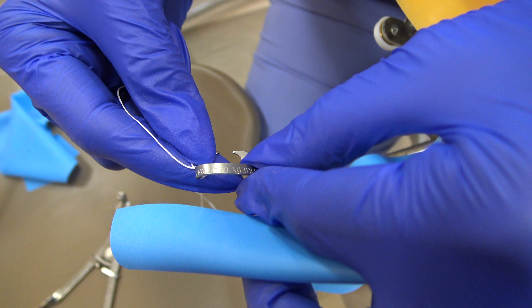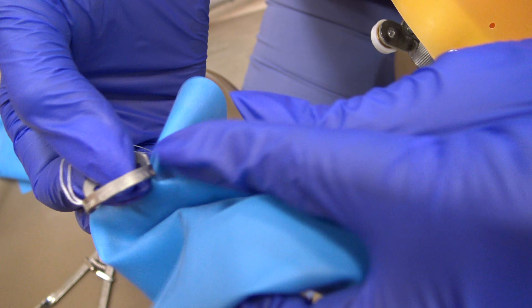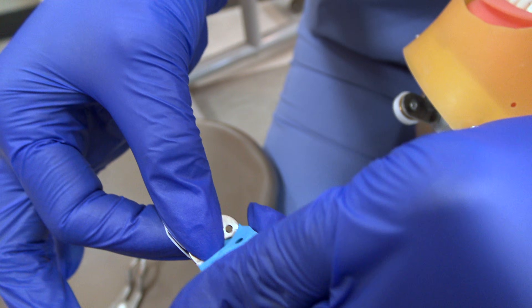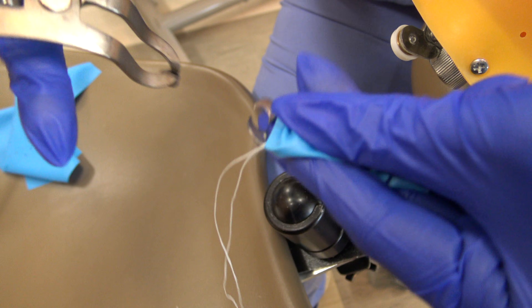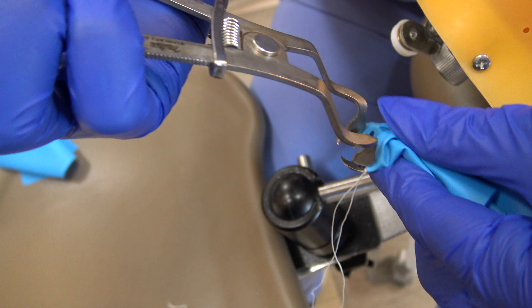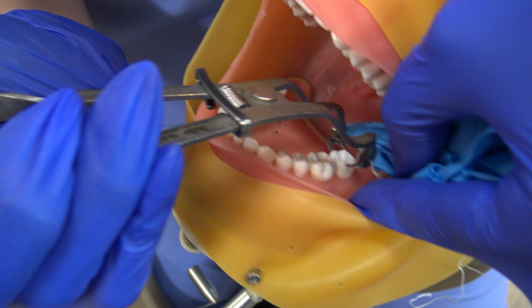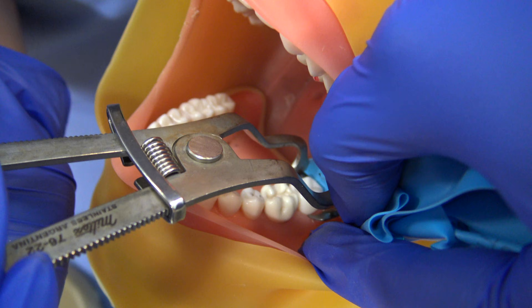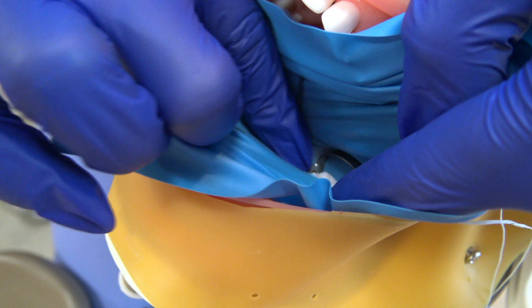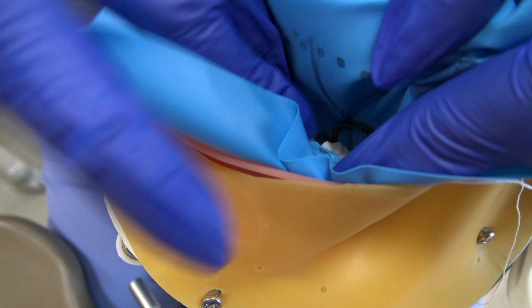Take floss and thread it through your rubber dam clamp. Insert your rubber dam clamp loop into the last hole, which should be punched at a five. You can grab the rubber dam clamp loop and the rubber dam in your hand. Engage the prongs of the rubber dam forceps around the holes, and you're going to insert it and then release. Now you can set the rubber dam below the clamp and start pushing down the rubber dam.